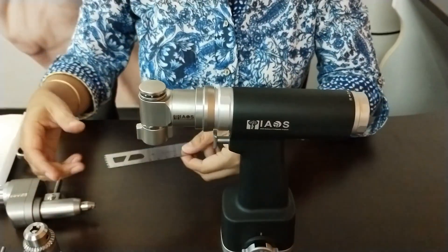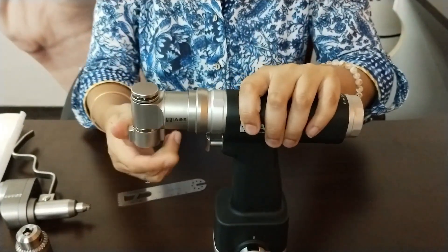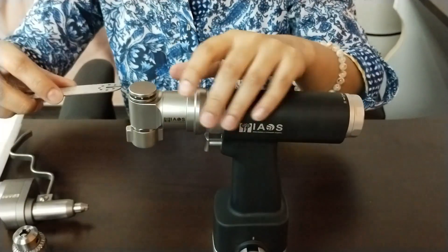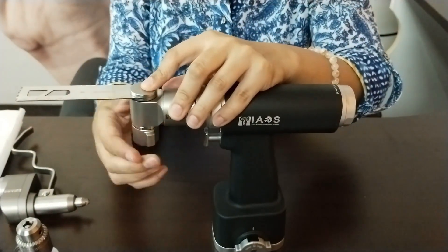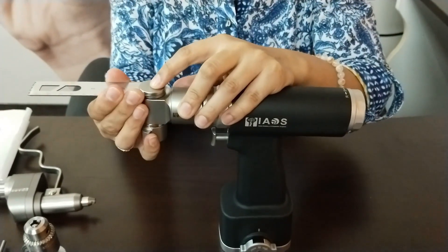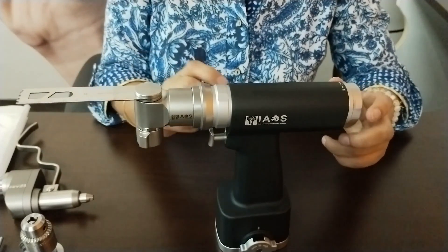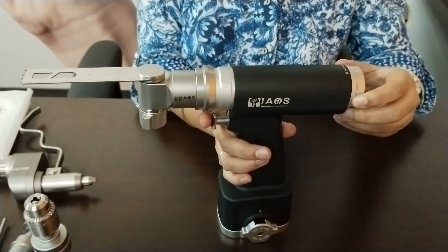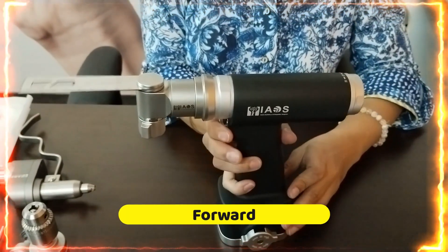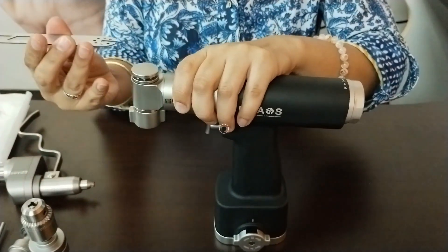I'll show you how to insert the blade. You can rotate the collar clockwise and anti-clockwise. Once pushed anti-clockwise, it opens. Insert the blade and then push it clockwise to ensure it is fitted properly. Make sure the handpiece is on stop to avoid any accidents. I'll just show you the forward and reverse modes, then take the blade out.